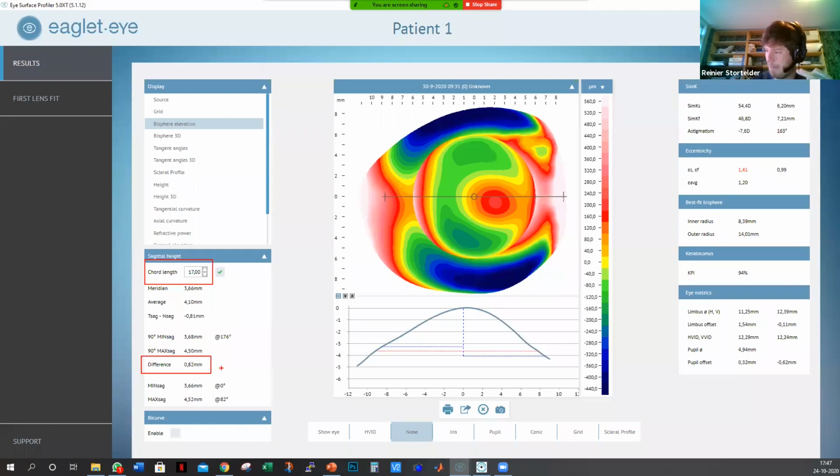And probably you don't believe this is daily practice, probably not daily practice, but I'm pretty sure that in a busy practice like Tom Arnold has, he sees it probably every 2 weeks, such extreme amounts of toricity. So they're definitely not rare.